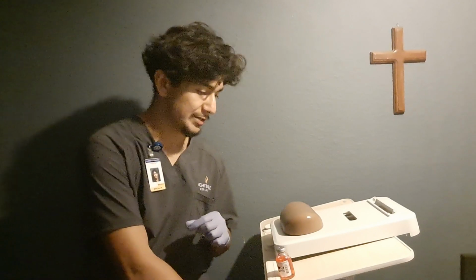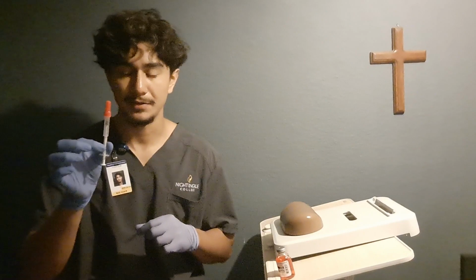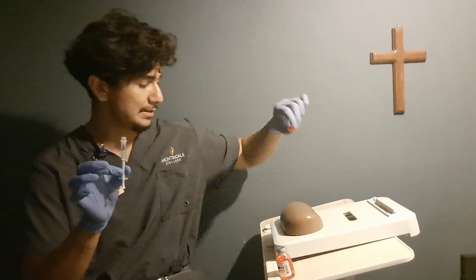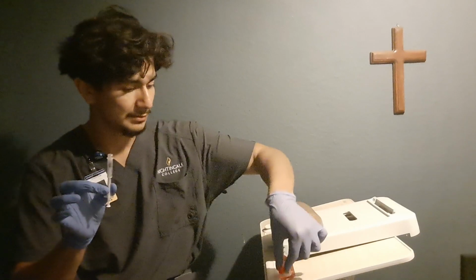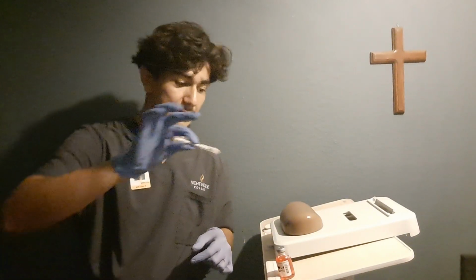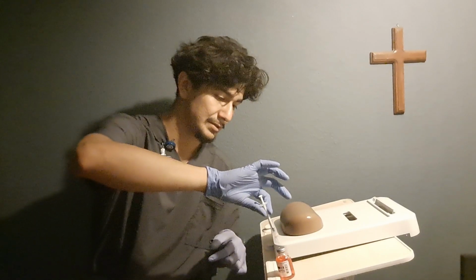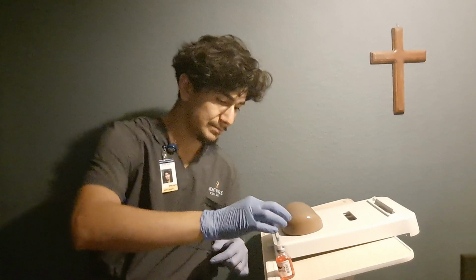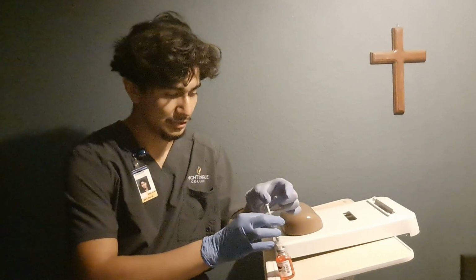Now that that's dry, we're going to go ahead and grab the needle, uncap the needle, placing it over here, and then we're going to go ahead and insert that into the vial. So we insert it, and then we inject the air.